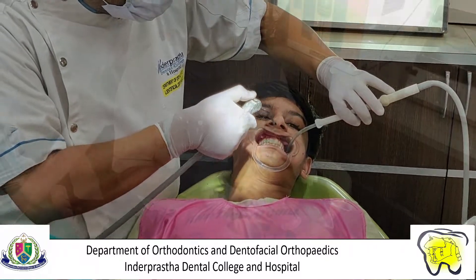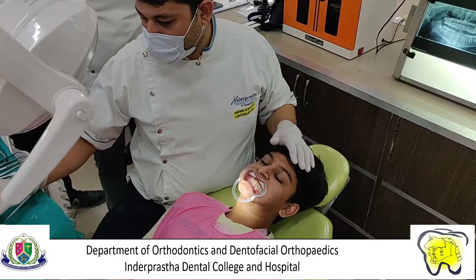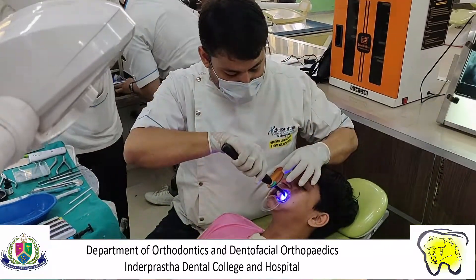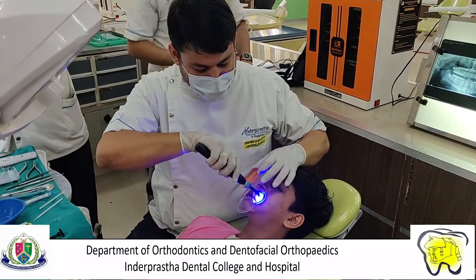The etchant is then washed off gently and thoroughly, followed by unidirectional application of primer over the tooth surface. Use gentle air pressure to spread the primer uniformly over the tooth, then apply the curing light over the primer.